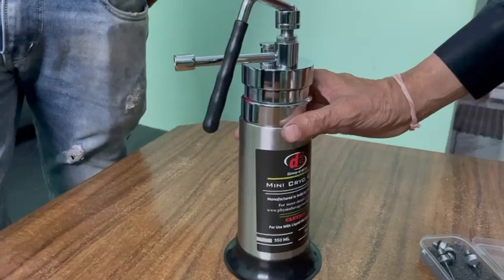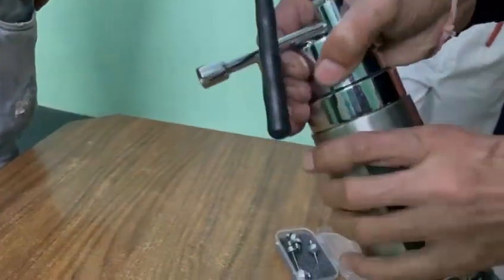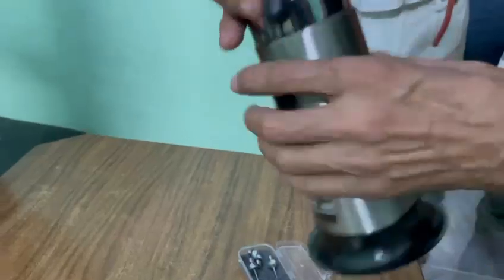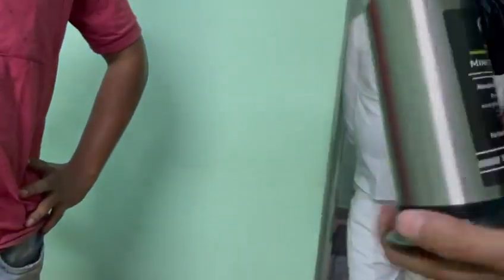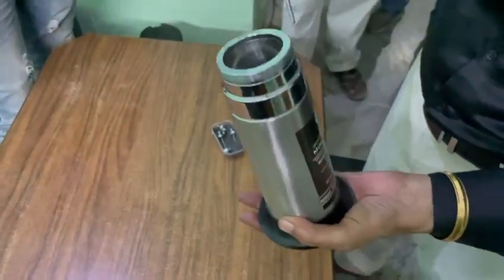We supply only empty cryogen — it will not be filled. When you receive the empty cryogen, it will come like this, with no liquid nitrogen inside.